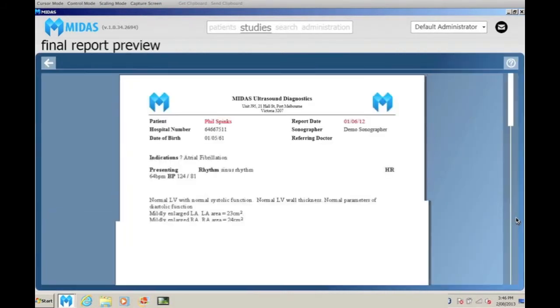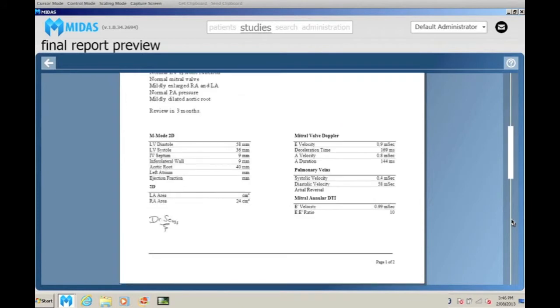This final report from MIDAS is then able to be imported into any SIS, HIS or patient management system.